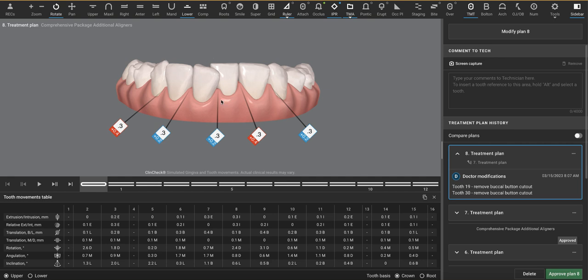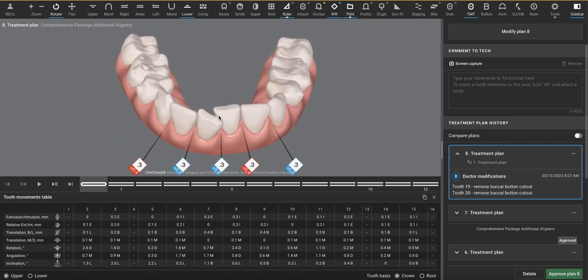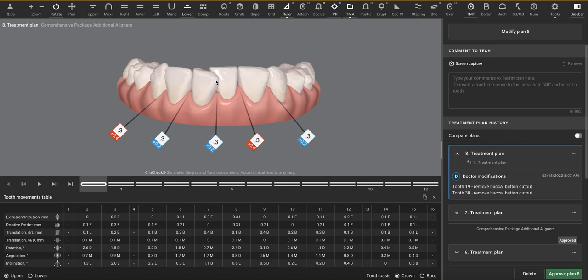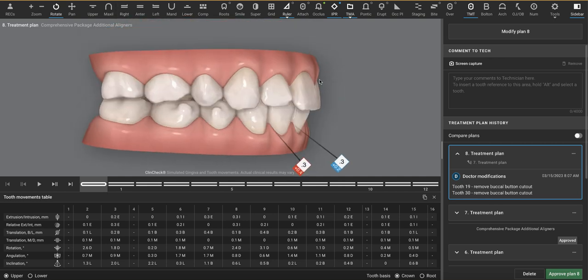I think her TMD actually exists because of the fact that she has this, I call this a distalizing interference. Her entire mandible might be a little farther back, which would include her condyle inside the disc space because of this little piston right here, or stiletto heel. As a result, she's more likely to have a posterior open bite created through just resolution of this lower anterior crowding because of how trapped she already is.